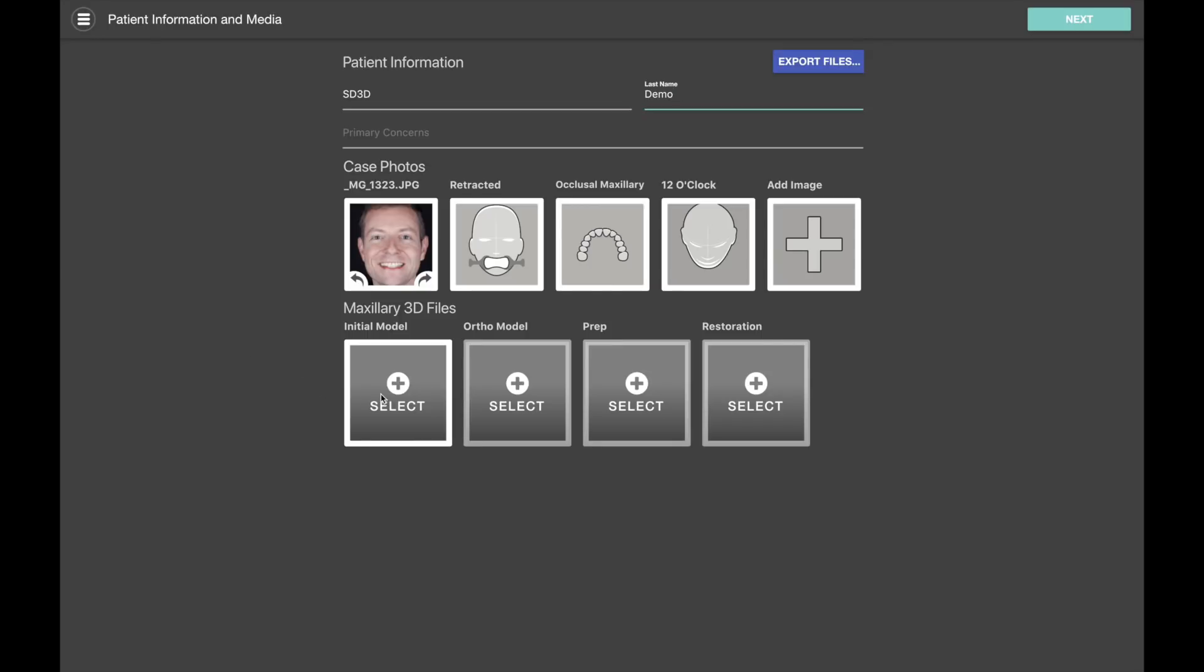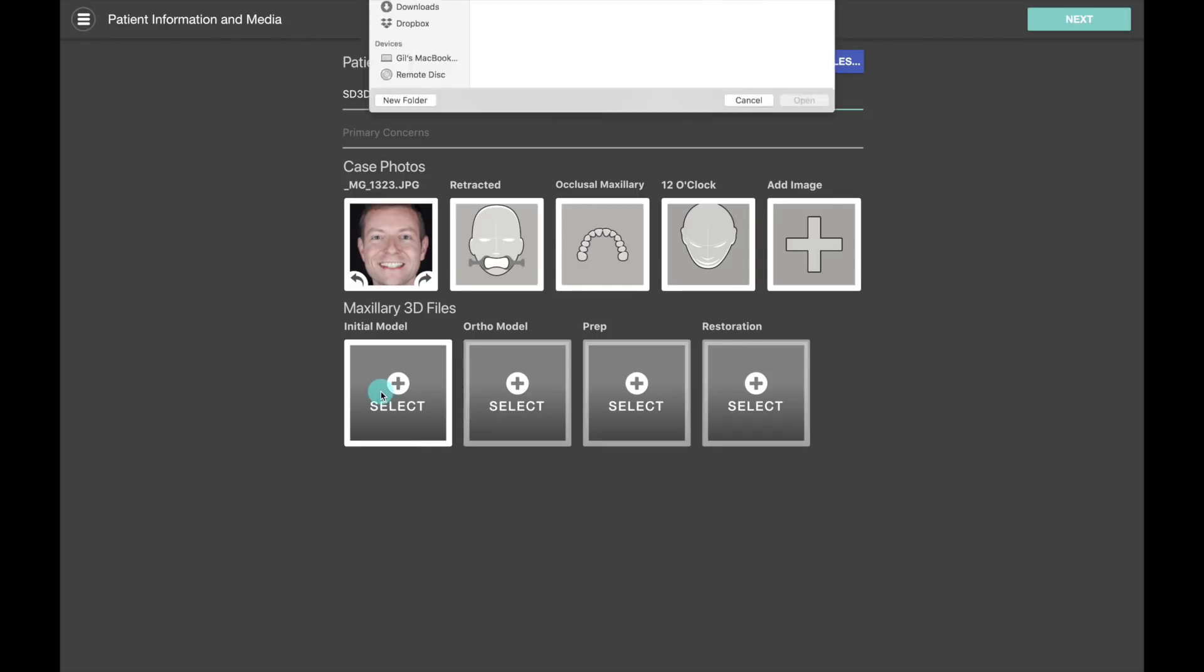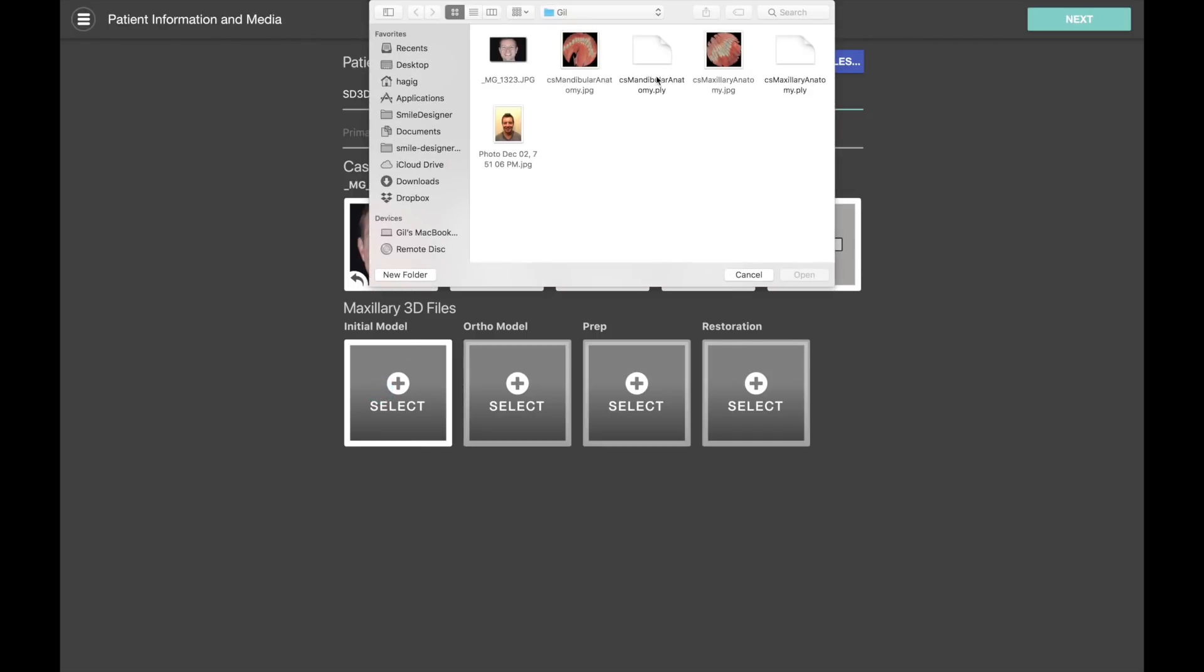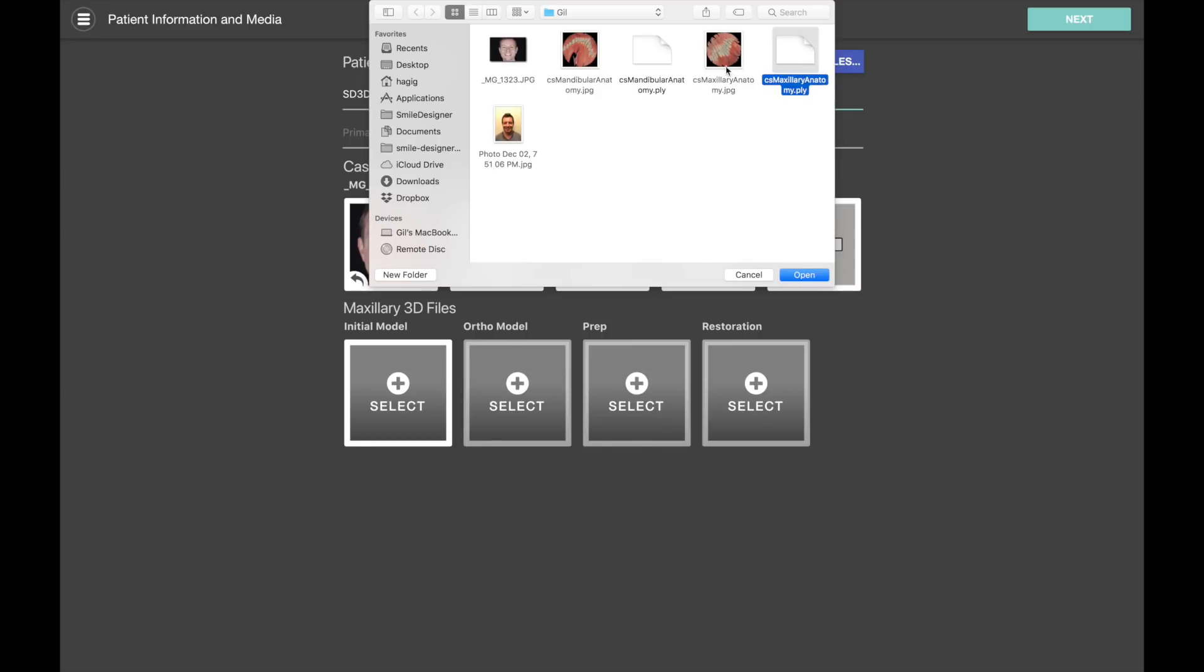So let's bring in our intraoral scan file. In this case we're using CareStream color scan file, and you can see that from CareStream you can export the PLY file that goes along with a JPEG file that contains the color information.